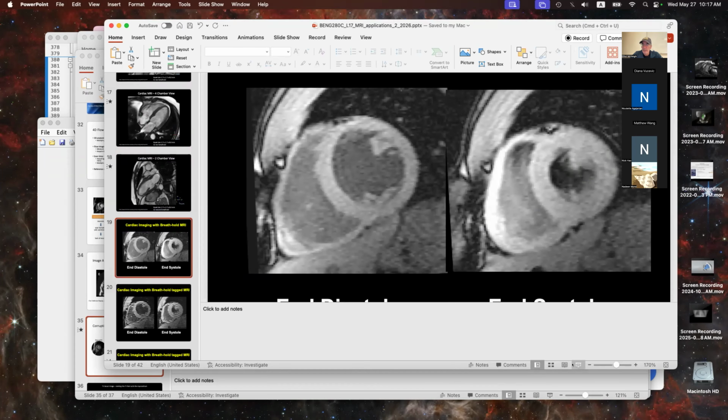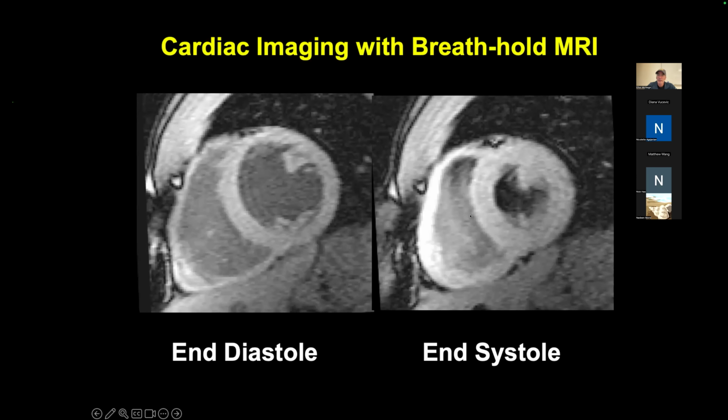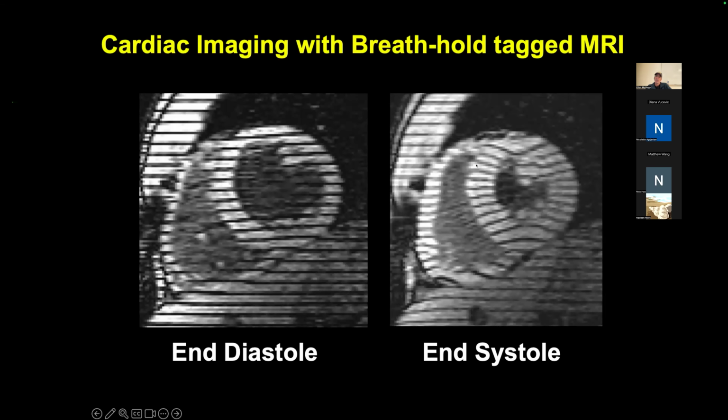If we want to essentially measure, we've looked at this before, if you want to measure motion really precisely, you can put markers in the tissue by applying what's called a pre-saturation pulse that knocks out the signal in parallel planes. And then if we do that here, we can see where it goes to at some time later. So if we look at this line, and you ask the question, well, what do you know about all of the magnetization vectors in voxels along that line?